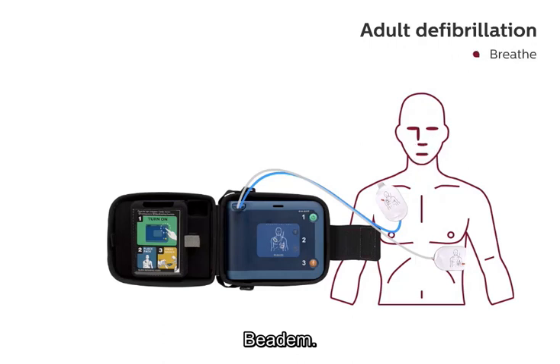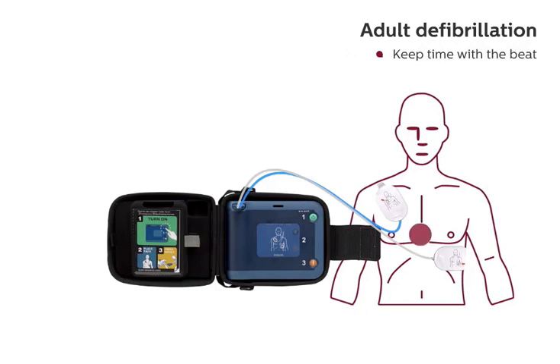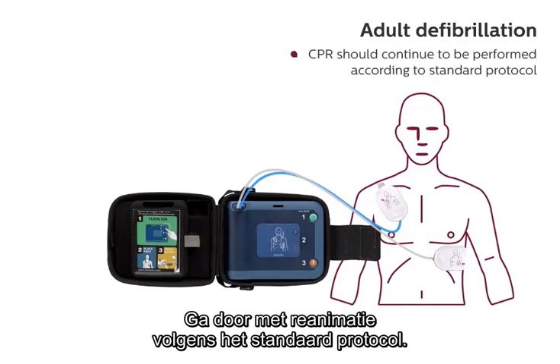Breathe. Breathe. Continue with compressions. Keep time with the beat. CPR should continue to be performed according to standard protocol.